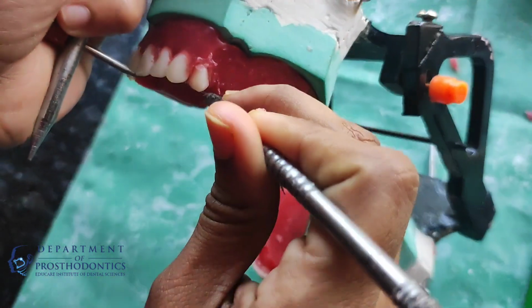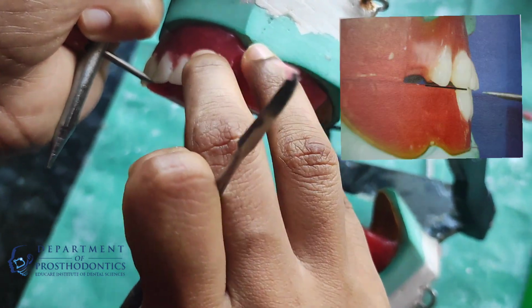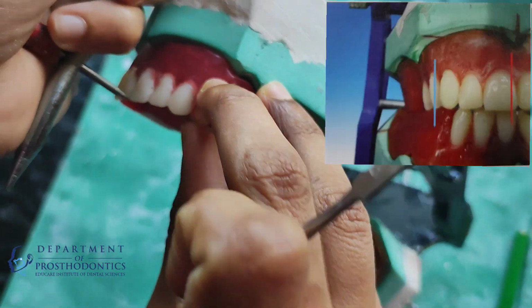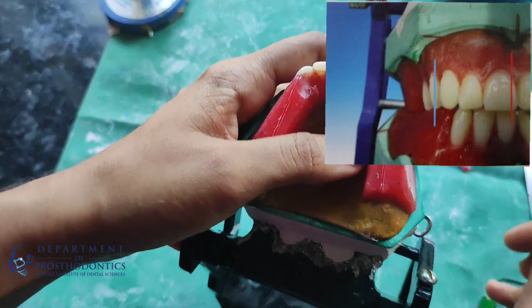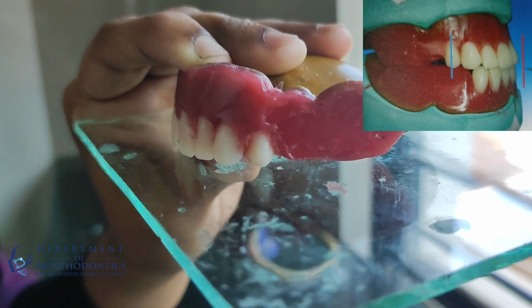The long axis of the maxillary first premolar is parallel to the vertical axis. The long axis of the maxillary first premolar is placed parallel to the vertical axis when viewed from the front. When viewed from the front, only a small amount of buccal surface should be visible.